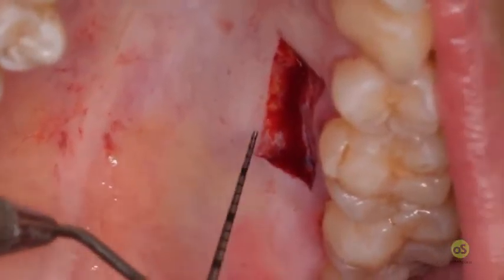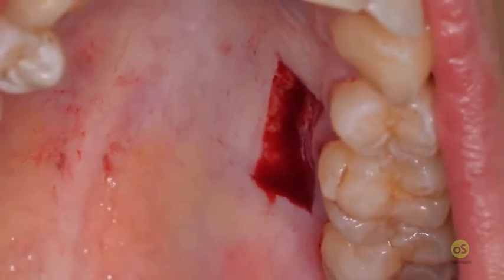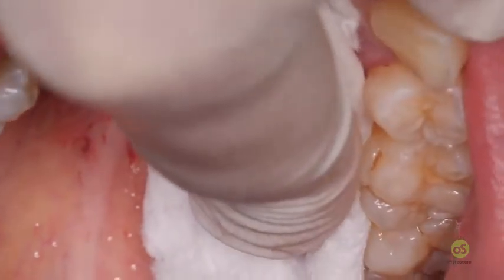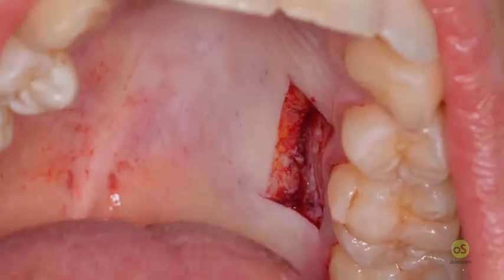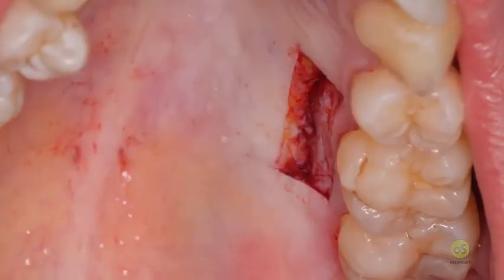Okay, now it's time to go to the palate. You see here there's the fatty glandular tissue that we left into the palate, and this is very, very important to reduce the pain for the patient. As much as you leave into the palate, the less is the pain for our patient. We apply some collagen sponge to this area.